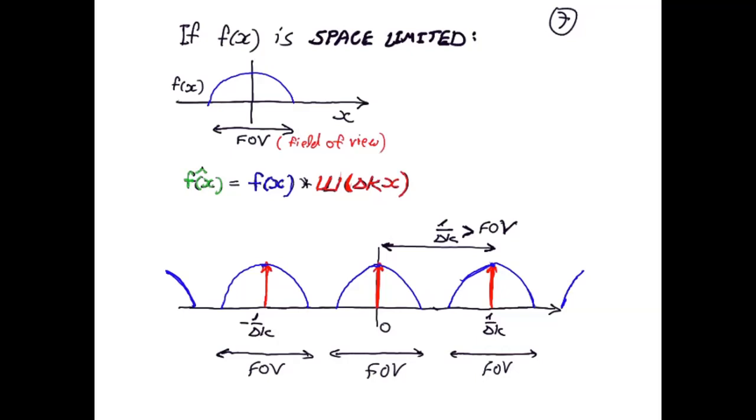It depends on which area you are trying to image. If you are imaging your head, then the field of view is limited there, so you could say that this is space limited. Okay, the field of view in the head is limited, but what about the rest of the body? Is it limited? I mean, does the scanner cover the entire universe? No, the scanner is not covering the entire universe. So obviously it's finite. Now the question is how much? Our scanner has a 70 centimeter bore and really the field is uniform across 40 centimeters, a circular field of view of 40 centimeters, that's it. That's pretty much the coverage. Anything outside of that we would not be able to image anyway. So absolutely, the image is space limited because our bodies are finite in space.